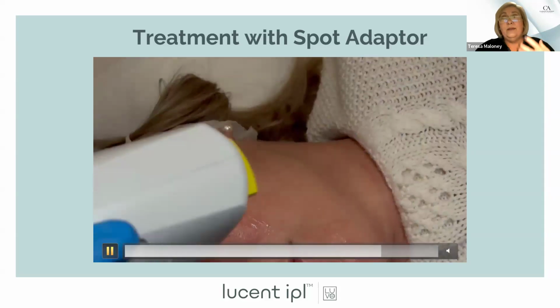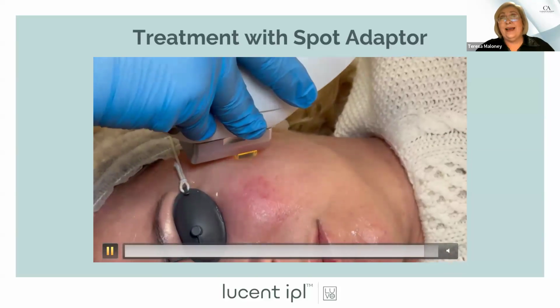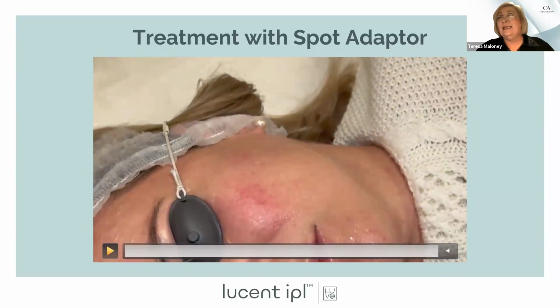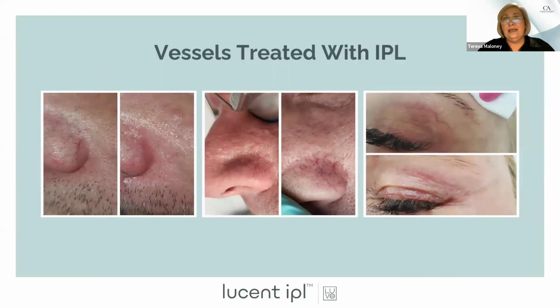If you put too much gel, that energy absorbs into the gel. I started in the day when we had the Vasculight, and that IPL came into Canada in 1997. There was no cooling in the sapphire, and you would put this much gel on, you would hover in the gel, you would not touch the skin to treat, and it only fired every 8 seconds. So we have come a long way in IPL treatments. And then you can get results like this. So by using that setting with the little square, you can do some really nice cleanup with some of the telangiectatic vessels that are around the nose and on the cheeks.